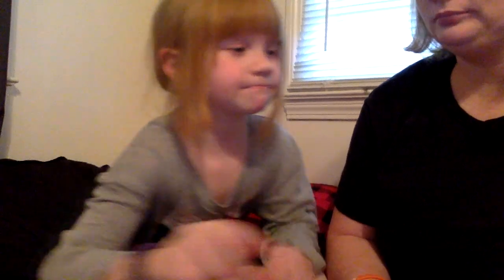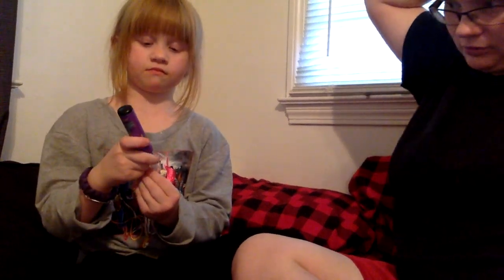Okay. Can you give me a... No, your finger's fine. She just washed her hands, so everything's fine. So, I'm gonna prick my finger. Hold it down.